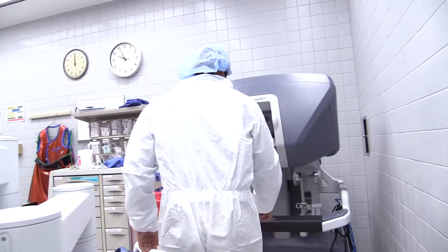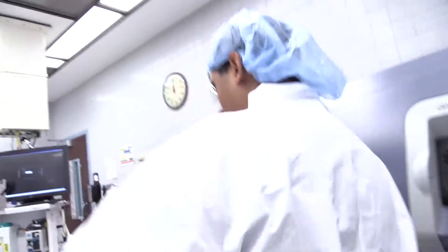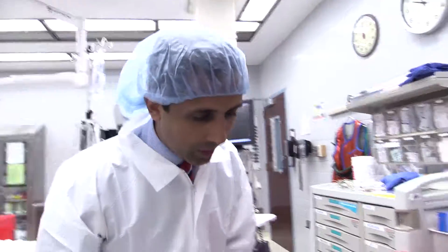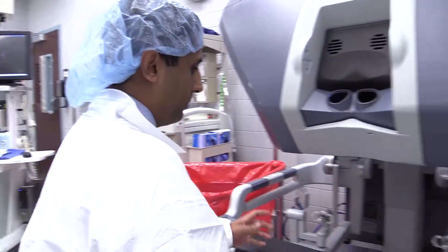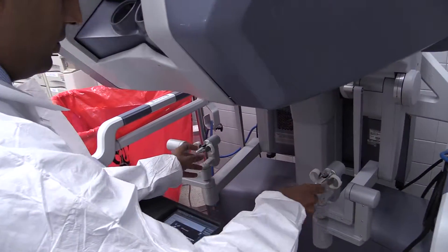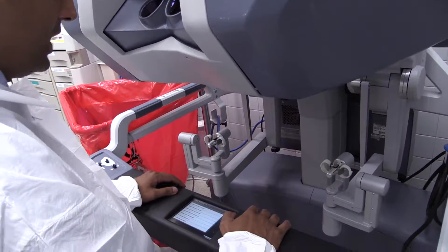This is the surgeon's console — this is the machine where the surgeon sits. The patient's right over here, the surgeon's over here, and this is a bit like doing a simulator or video game. Have you ever played a video game before? We've got your hands going into these little finger slots right here, and the movement of your hands translates into movement of the instrumentation.